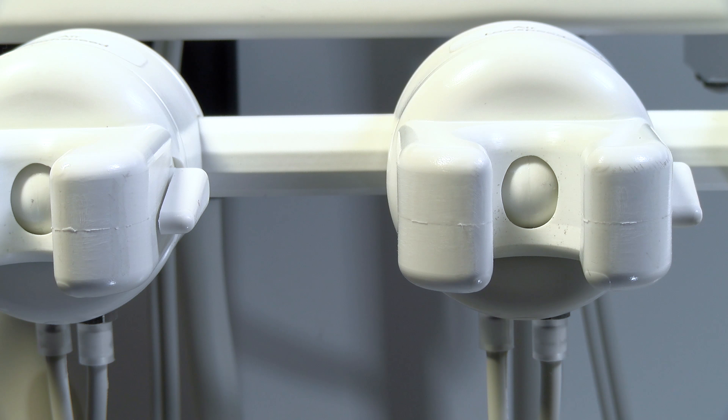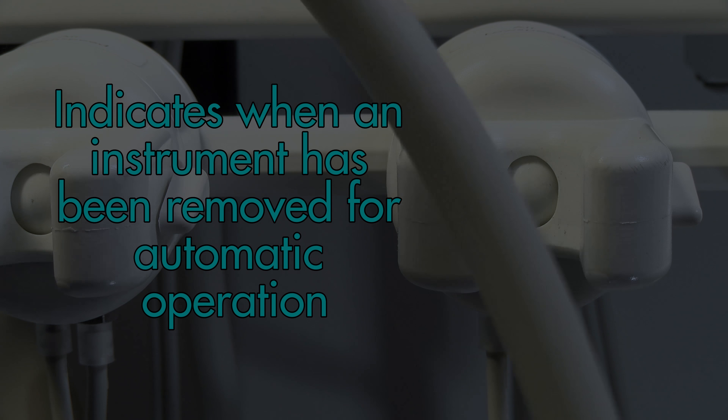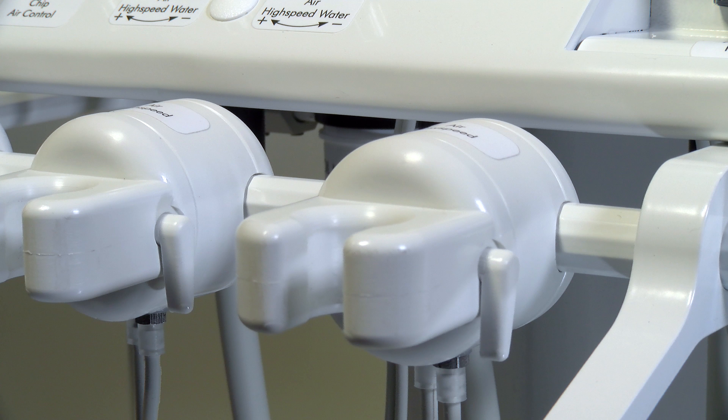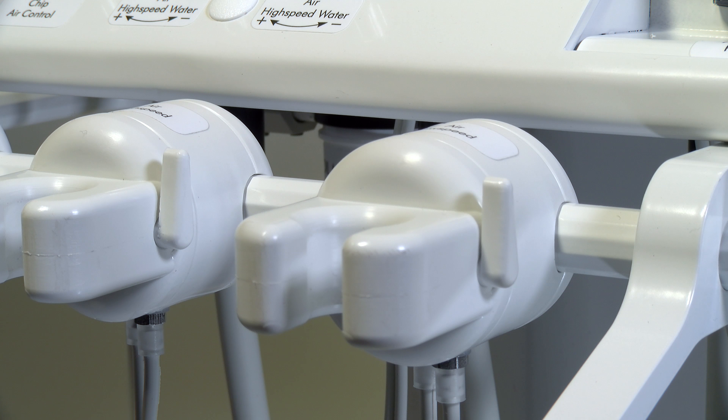The ball design in the base of the holder exactly indicates when an instrument has been removed for automatic operation. A side lockout lever enables the holder to be locked out to allow assistance to change burs or tips while another instrument can be in use.